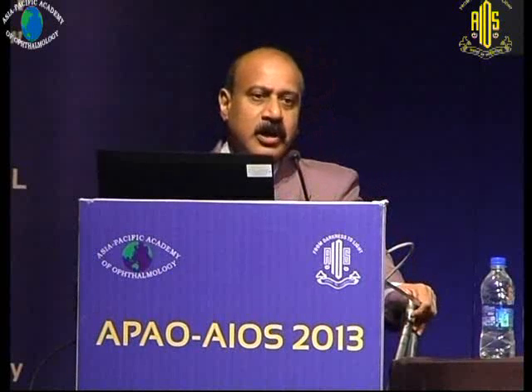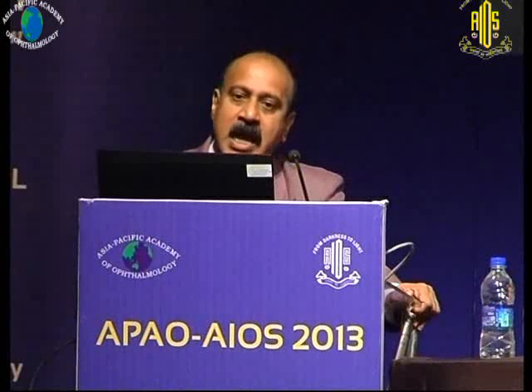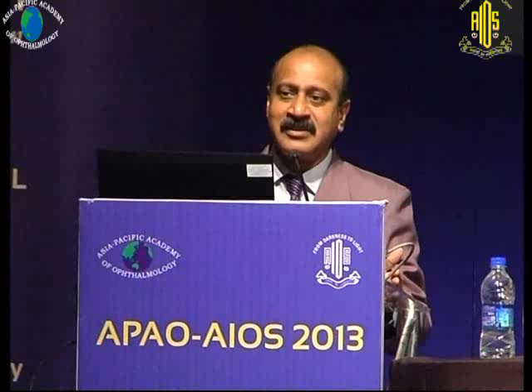I would like to conclude my talk on primary vitrectomy and rhegmatogenous retinal detachment: PPV is more preferred now for rhegmatogenous retinal detachment, except for the complex detachments where you may have to add additional support with a buckle. Scleral buckle is a preferred modality for a simple detachment with an inferior break, because there, if you are using oil, the support may not be that great. Always use PFCL in complex cases like giant retinal tear, and current success rates with the tailored approach are almost approaching 100%. So you need to plan whether you are going to succeed in the first place in 100% or not.